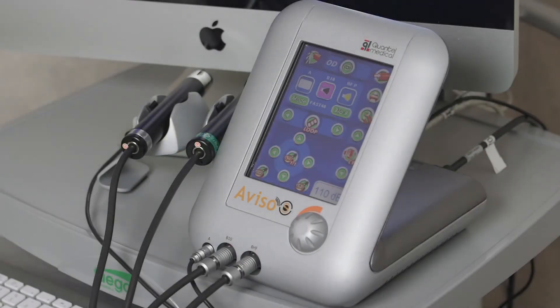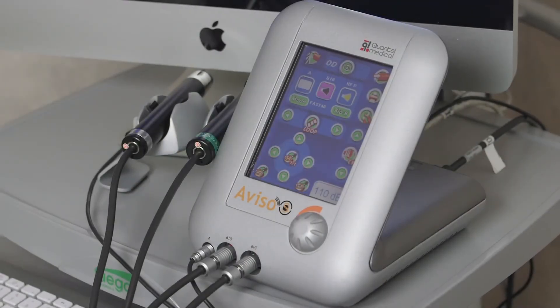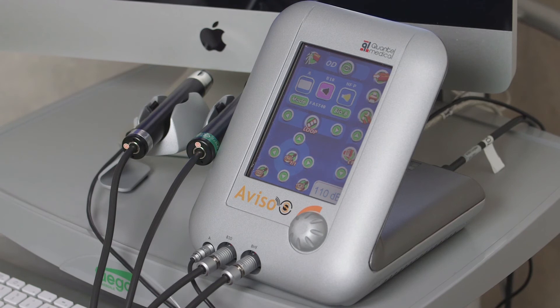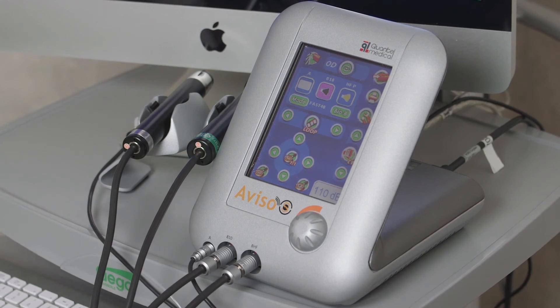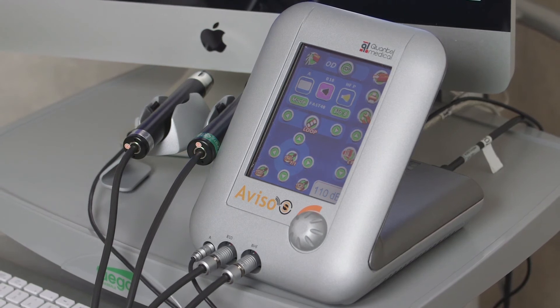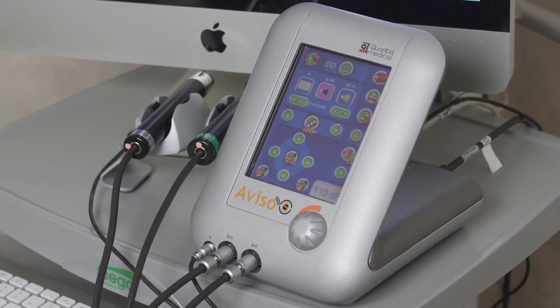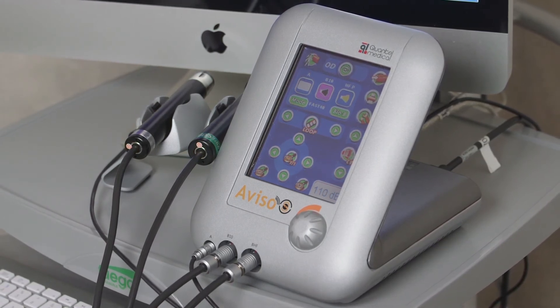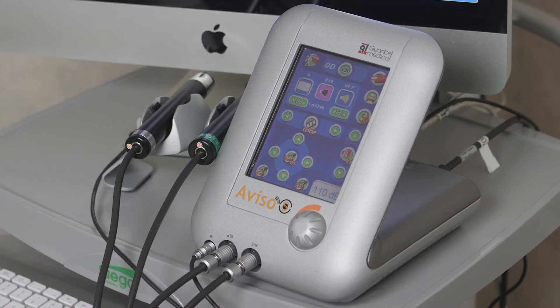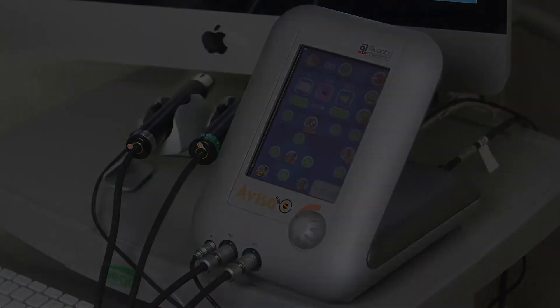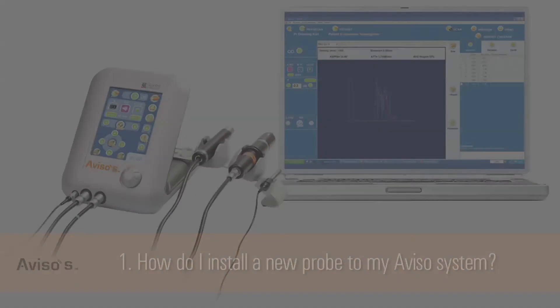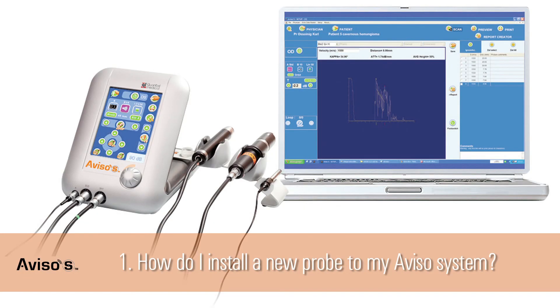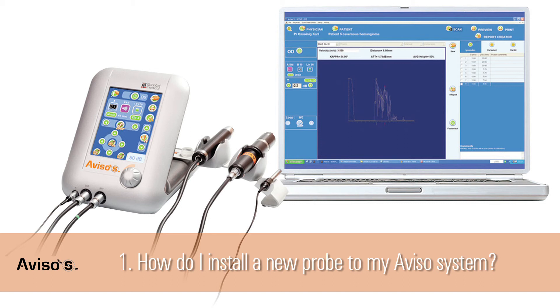With the key features of the Aviso-S hardware and software in mind after this initial review, we will now turn to the top five most frequently asked questions about this device. Question 1: How do I install a new probe to my Aviso system? Every new probe comes with installation instructions written on the probe file card, and each probe has specific parameters. Follow these steps to install a new probe. Insert the probe's corresponding CD-ROM in the drive and press the Add button.